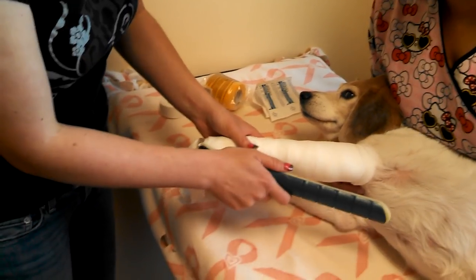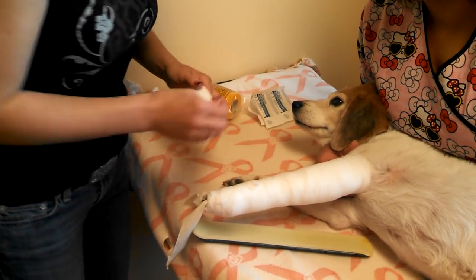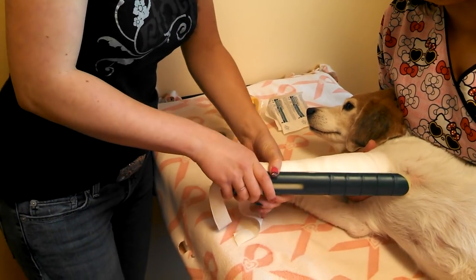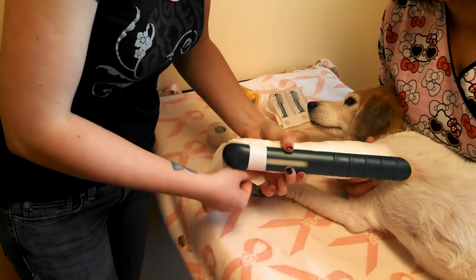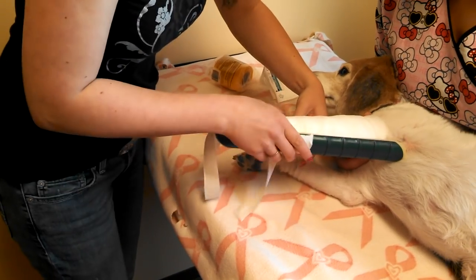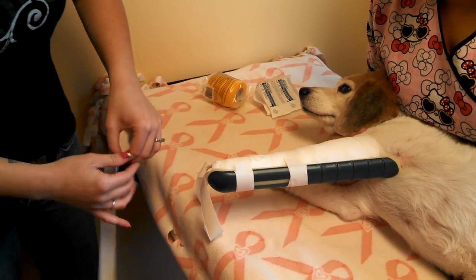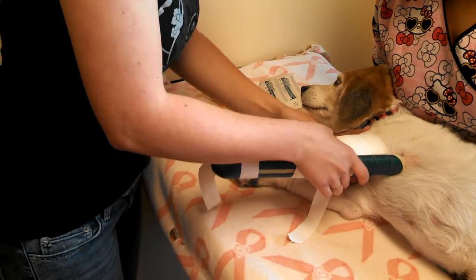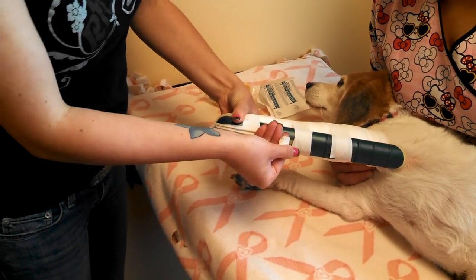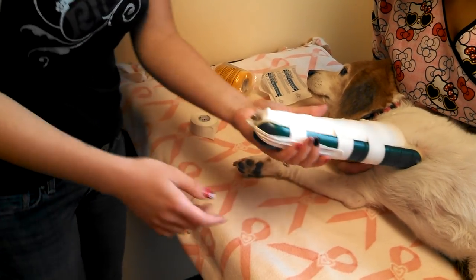Then we'll apply the splint. The foot should sit in the cup. You're going to fasten the splint to the leg with three to four strips of tape — again, you have to be sure they're not so tight that they're cutting off circulation, but you want enough support given to the leg. Then put your stirrups up over the bandage, getting at least one to support the spoon splint itself. You should be able to see toenails, but no toes.